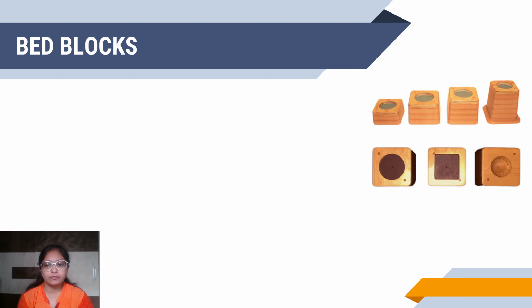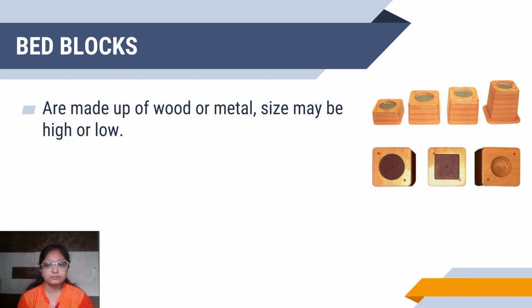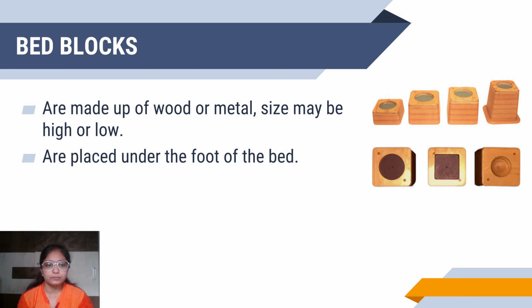This is the picture of bed blocks. So bed blocks are blocks made up of wood or metal, and their size may vary from high to low. Bed blocks are placed under the foot of the bed so the bed can be raised.